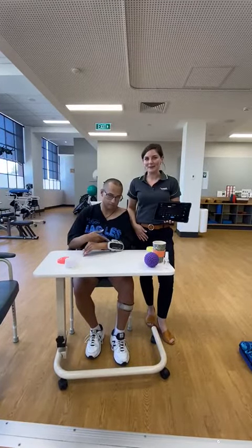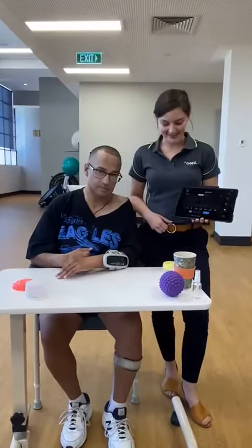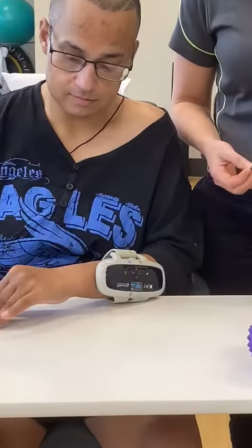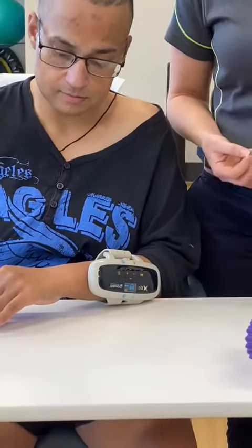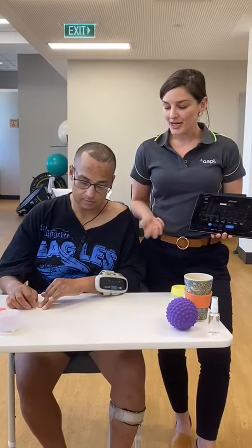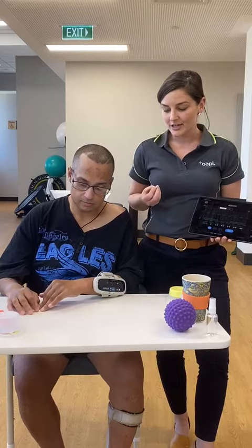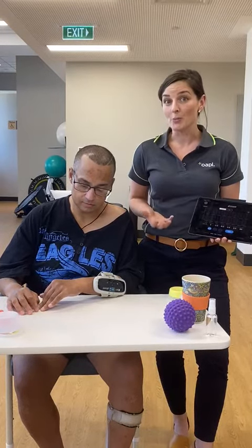Today we're introducing the Omni High 5. This is the device that Junior is wearing right here. It's an electrical stimulation unit which also uses surface electromyography to read Junior's muscle contraction. When Junior contracts his muscle, the device uses electrical stimulation to open the hand.